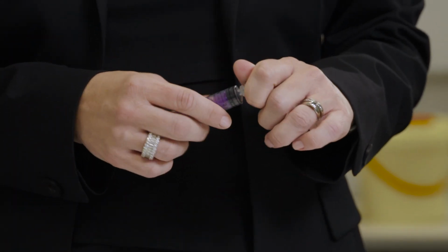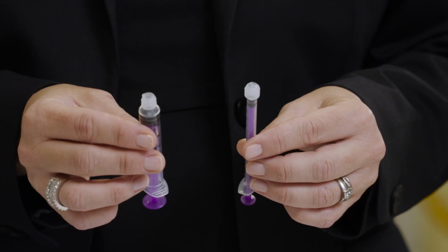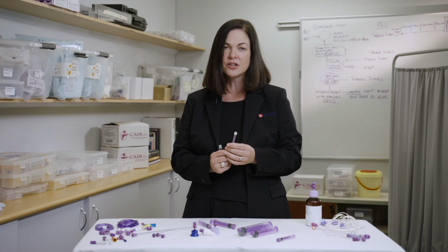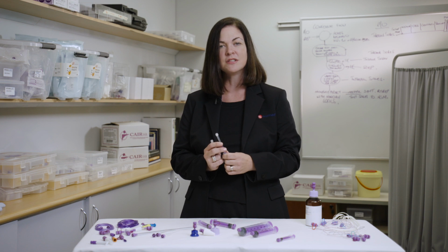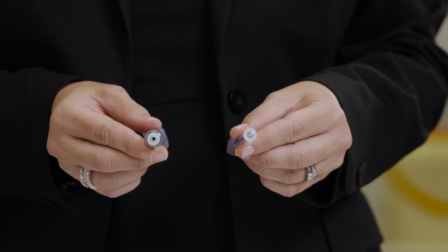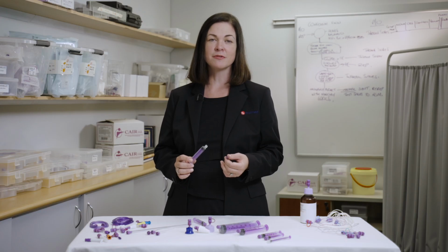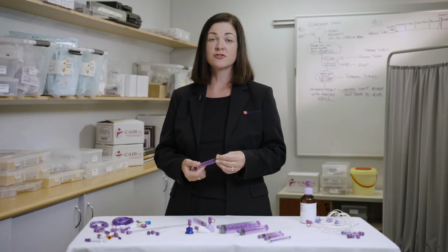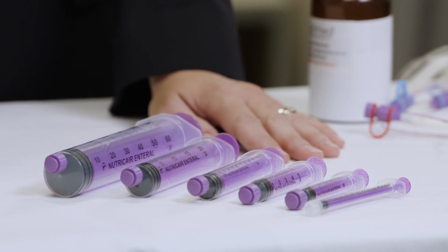The Enfit female syringes are available in 2 tip versions, the low dose and standard dose. The standard Enfit tip is used on most syringe sizes. The low dose tip was developed to address clinicians' concerns about dosing accuracy when delivering small medication volumes. Due to the design of the Enfit syringe tip, the manufacturer recommends capping syringes once filled. Washing instructions are available with our 14-day reusable syringe range.